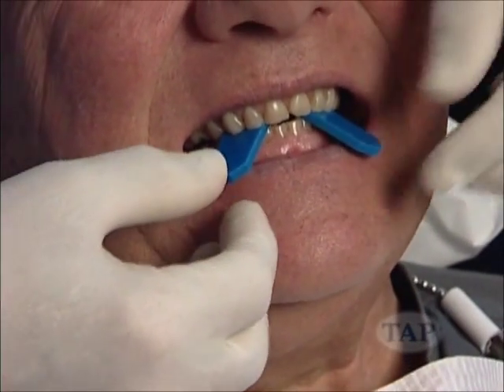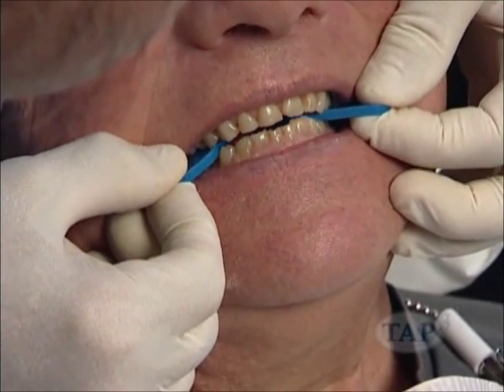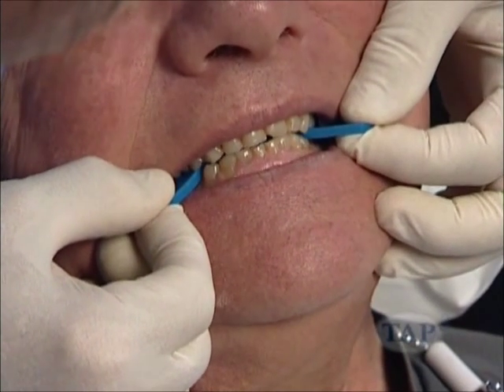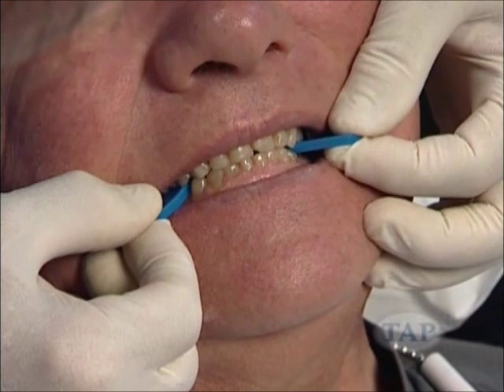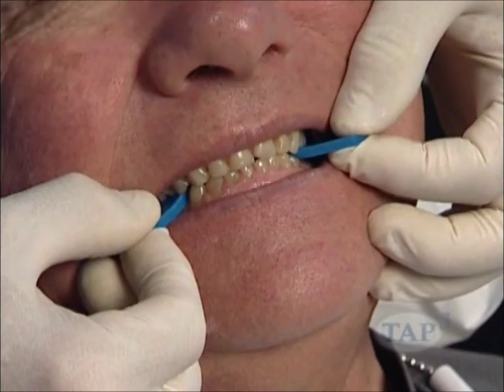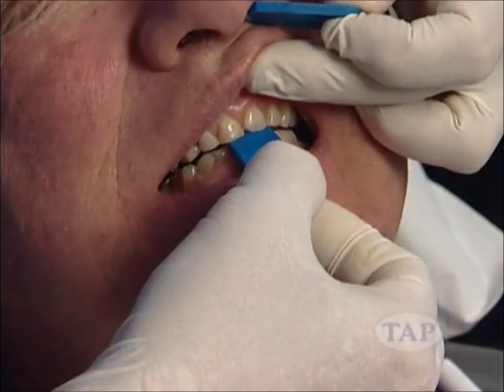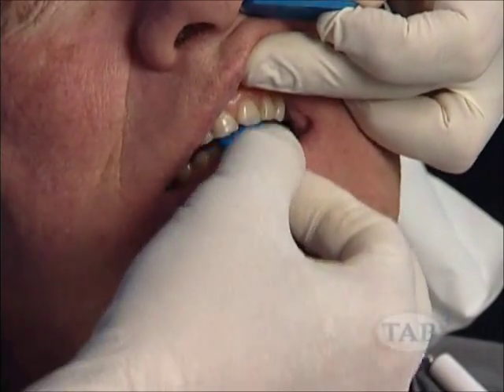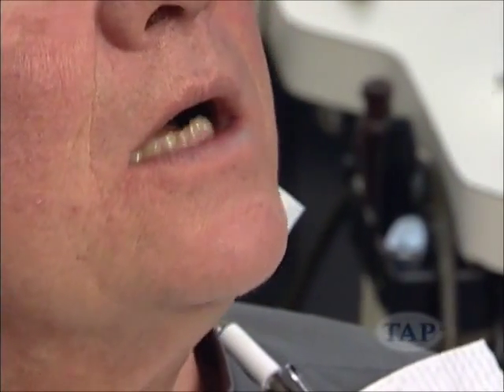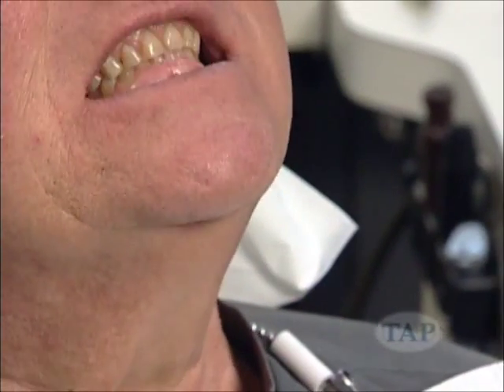Take both tabs provided with the patient's case. Place one tab between each canine tooth. Instruct the patient to move their lower jaw back and forth. When the patient's jaw is in the back position, have the patient squeeze as if to put the back teeth together. Repeat the exercise with the tab between the central incisors. Remove the exercise bite tabs to see if the teeth come together. Repeat the process until the jaw is back in normal bite position.